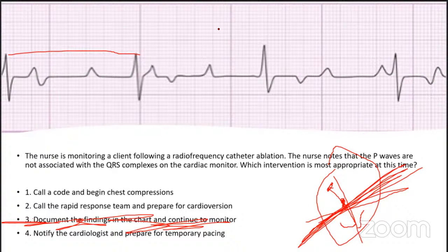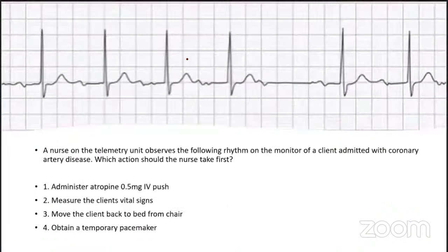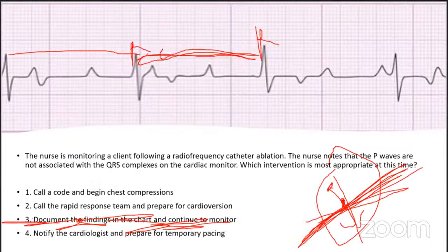analytic person. I'm mainly looking at an ECG strip. You should be able to say, is this rhythm fast or is this rhythm slow? Do I have a tachycardia or do I have a bradycardia? Well, tomorrow we'll look at how to identify tachycardias and bradycardias, how to count rate and all of that. Again, just by looking at, so this is our R wave, and this is our R wave. Just by looking at the RR interval, look at the distance between them. That tells me this rhythm is slow. Now look at the RR interval. Look at how close that is. That tells me it's probably a faster rhythm than the last one. So you want to look at first glance, what is before me? Does this rhythm look fast or does this rhythm look slow?